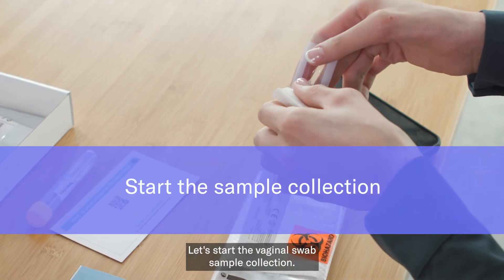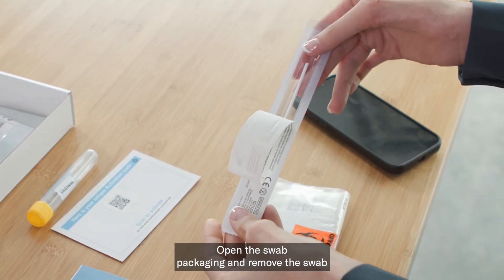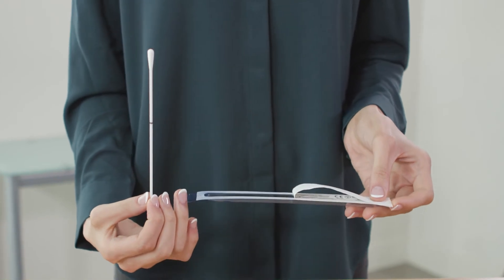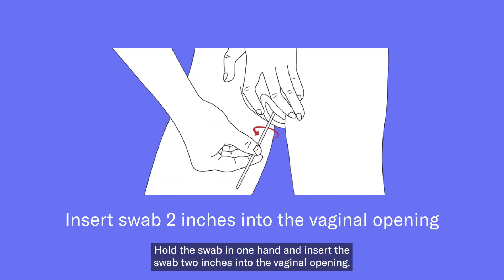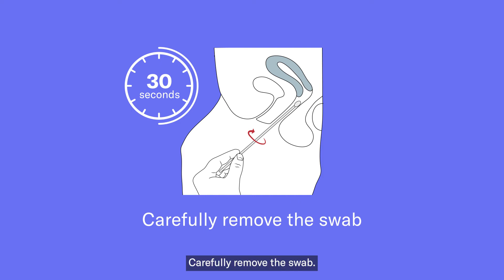Let's start the vaginal swab sample collection. Open the swab packaging and remove the swab by holding the other end to the tip. Hold the swab in one hand and insert the swab 2 inches into the vaginal opening. Gently rub the swab against the walls of the vagina for 30 seconds. Carefully remove the swab.